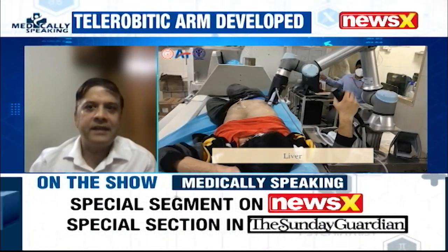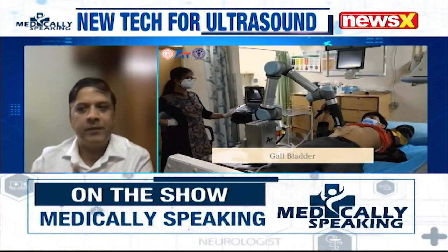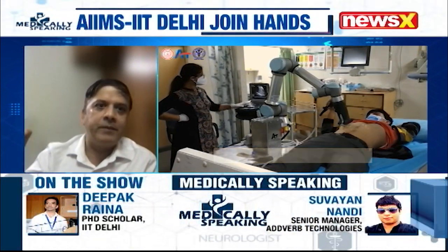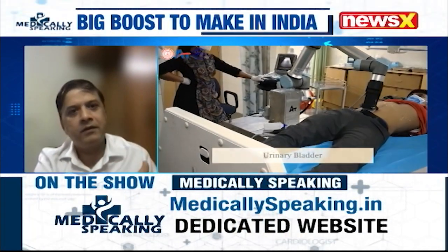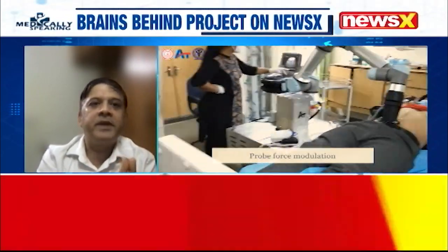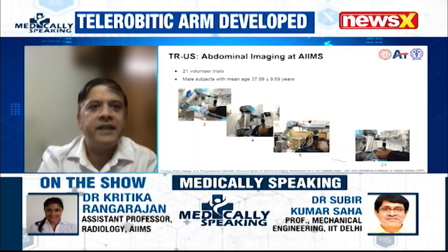So what we have essentially done in this case is that this probe is now not being held by the doctor, but it is held by a robotic arm. Now there is a doctor who is standing in, in this case, the next room, which is a safe distance from the COVID patient. But in future we can expand it to a new building, a new city also. The doctor has got a haptic device, that's what we call it. And the moment the doctor moves this haptic device, the same commands are transferred to the robotic arm, which is on the side of the patient. Now, the critical factor in this particular case is also the pressure feedback. The doctor is moving the probe while sitting in the other room, but the other important factor is that there has to be a certain amount of pressure that needs to be applied.